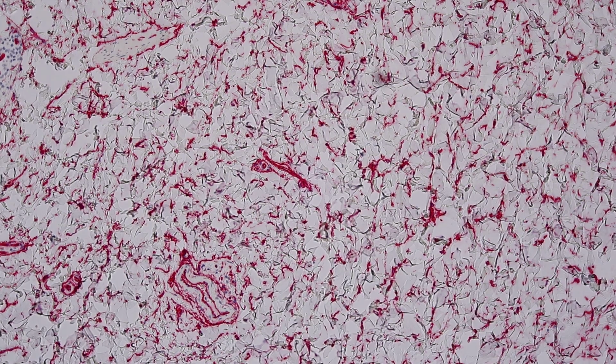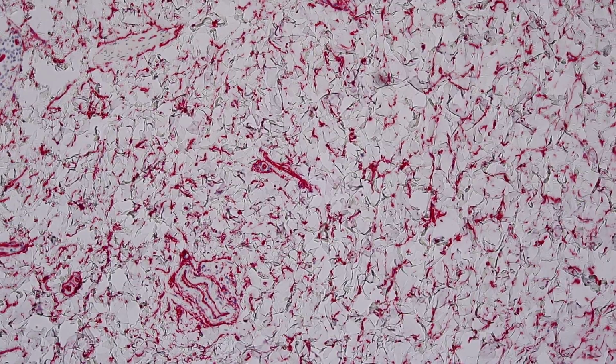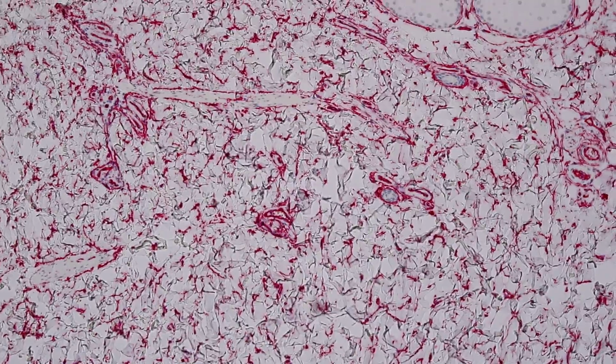I've heard lots of different explanations for what these cells actually are, but some form of dendritic cell that lives in the dermis and populates the dermis stains with CD34. And that's why a lot of different fibroblastic proliferations and fibrohistiocytic things can express CD34. So it's useful in certain contexts, but you've got to be really careful with it. And of course, it stains vascular tumors and vascular lesions. So CD34 strongly stains the dermis, which is one pitfall.